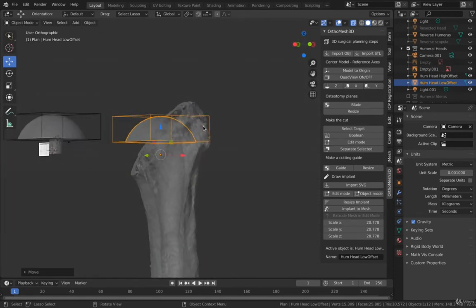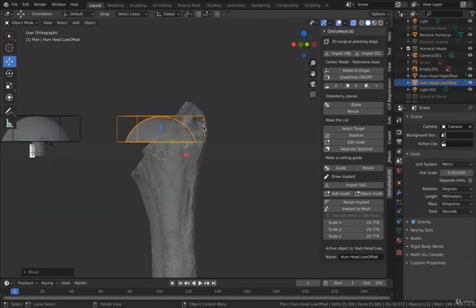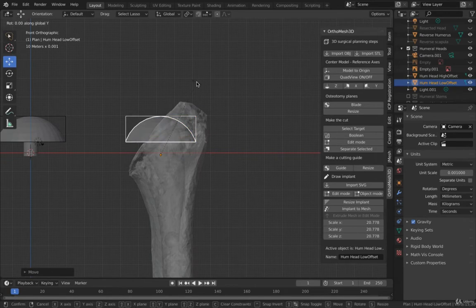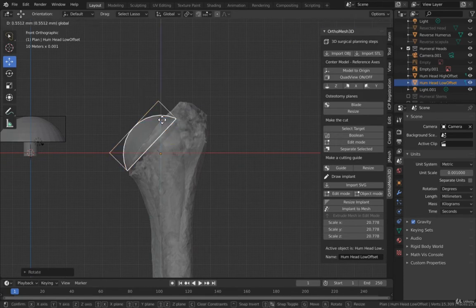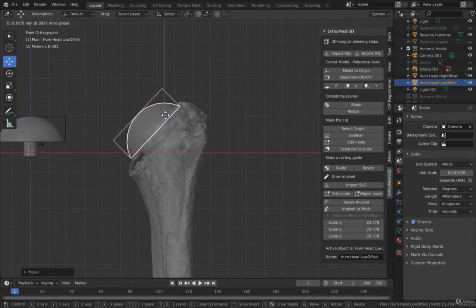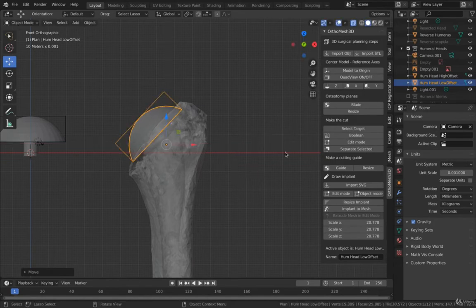I'm going to rotate this, and then it looks like I have to rotate it on the y-axis, so I'm going to press R, Y, and I'm going to start rotating it until I match the curvature, actually the angle of resection. And this is a pretty small humeral head, so we need a larger piece.